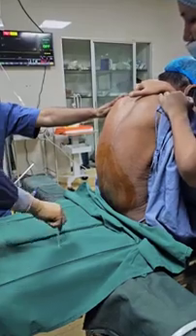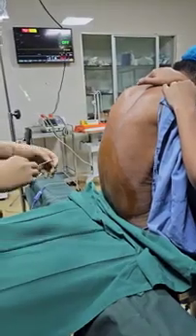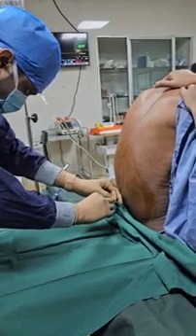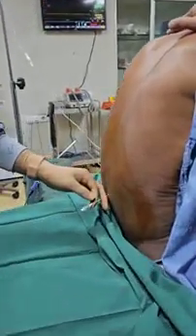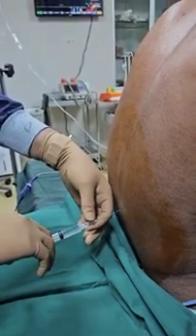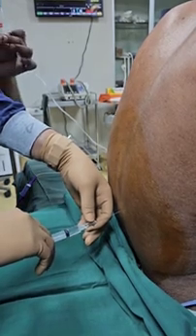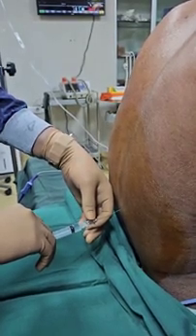We are slightly waiting for 1 minute. Okay, we have completed 1 minute, and now we are going to introduce our spinal needle, which is 25G. Okay, we got the pop feeling, and we are seeing the CSF coming out of the needle. Okay, then we connect the syringe with the hub of the needle, and push forward very slowly. We are pushing our drug, which is very simple actually.